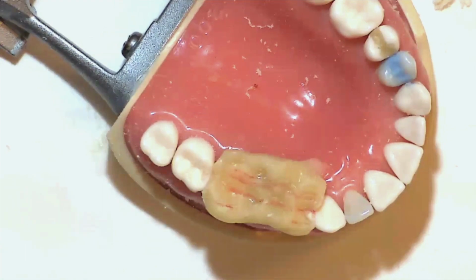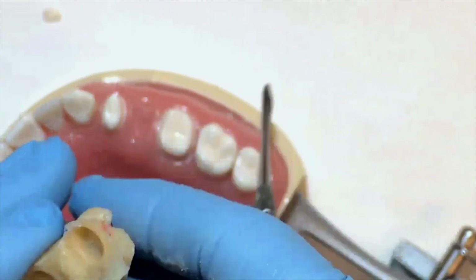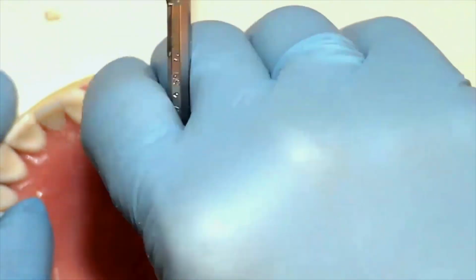We need to leave that on there until the rubbery stage, and then we can remove it, check it. A little out of focus here, but there we go. And then put it back on until the final set.